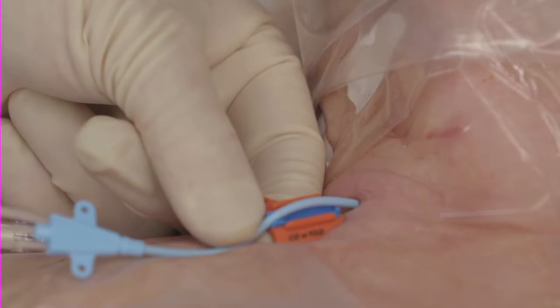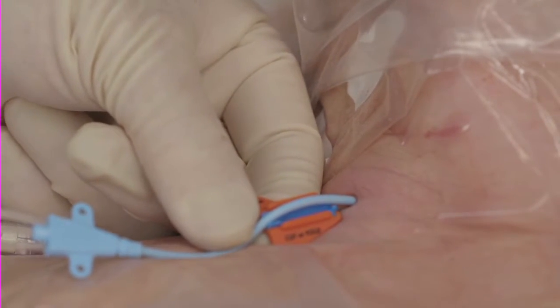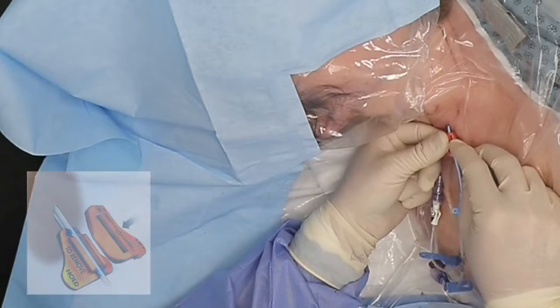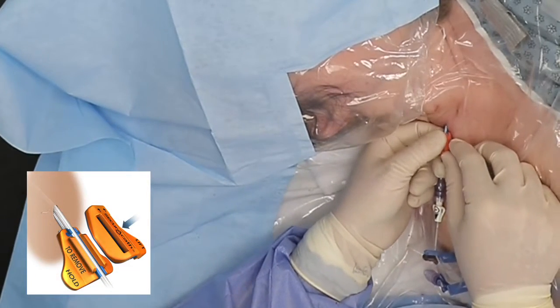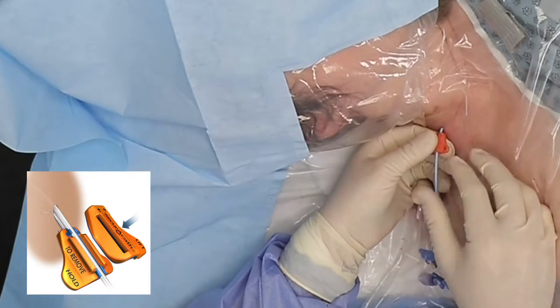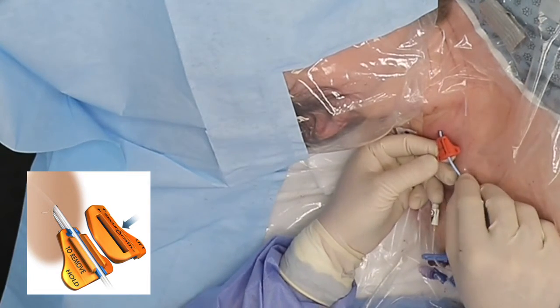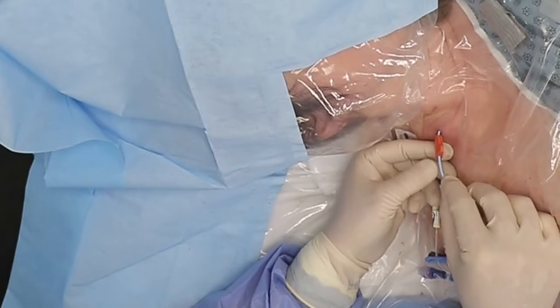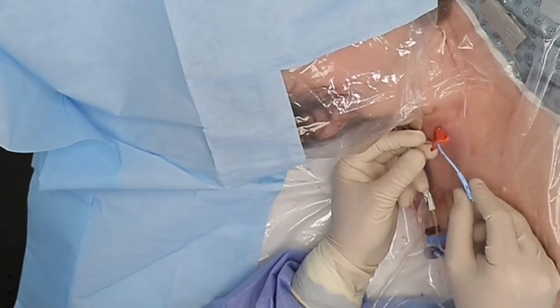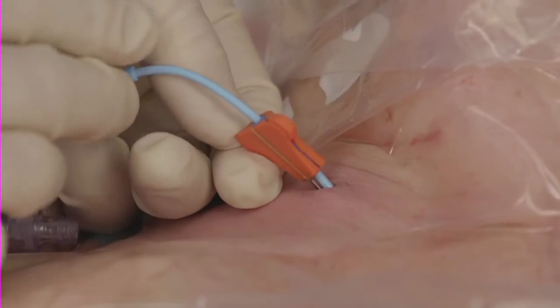Press the catheter into the blue groove. Place the cover on the base by pressing firmly on the center and then the edges of the cover, while holding the base to affix the SecuraCath to the catheter shaft. A click may be felt and heard when the cover snaps onto the base. Visually inspect the edges of the SecuraCath to make sure the cover is fully engaged with the base.